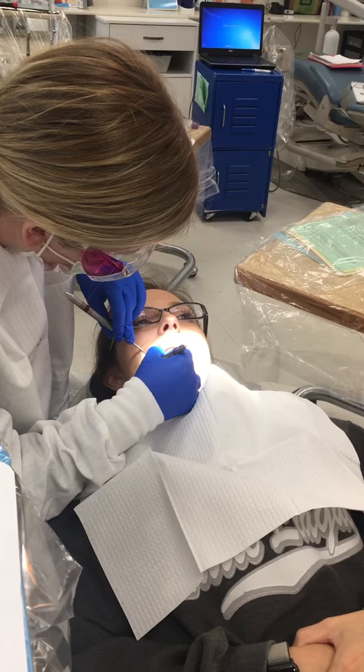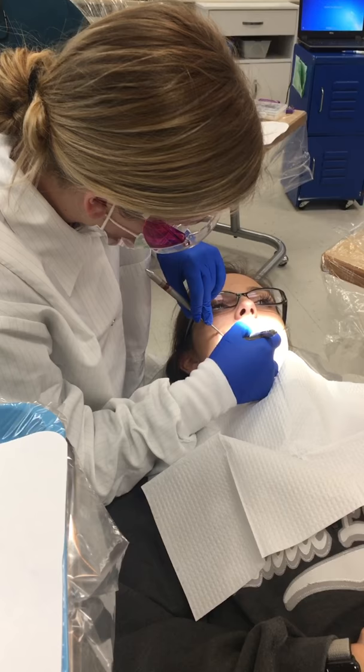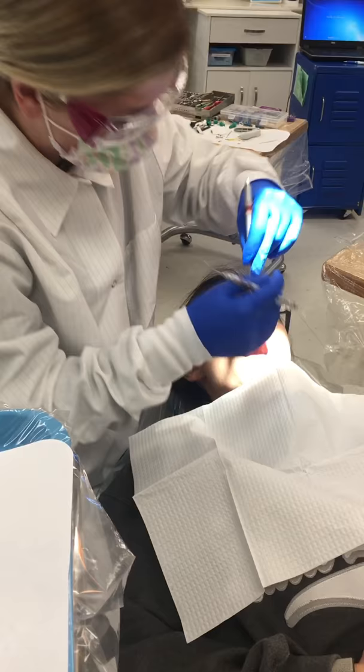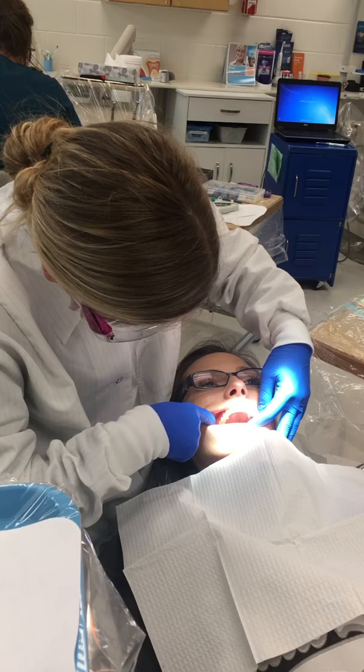3-2-3, 3-2-6, 6-2-4, 4-2-5, 3-2-3, 3-2-3, 3-2-3, 5-2-6 — and there is bleeding: mesial of 2, distal of 3, mesial of 3, distal of 4, mesial of 4, distal of 5, and that is it.